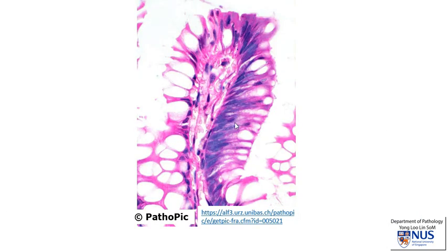Here is an even higher magnification view taken from PathoPic. Here is the normal colonic mucosa with very basal and rather small nuclei and very prominent goblets. In contrast, this is the dysplastic epithelium with low-grade dysplasia showing tall cigar-shaped nuclei located in the base and in the middle of the cell, and sometimes even closer to the luminal surface. There is usually a very abrupt transition from dysplastic mucosa to normal mucosa.